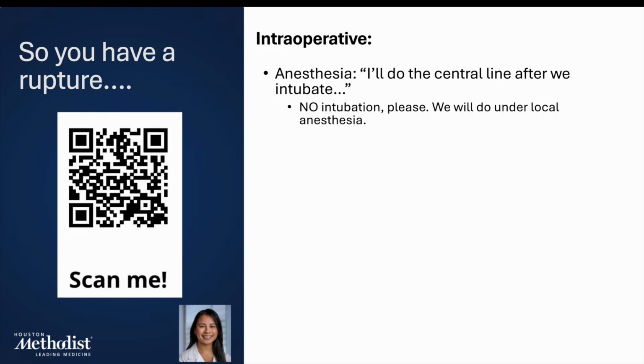No intubation, please. We will do this whole thing under local anesthesia, and this of course is to prevent any crash on induction. If you end up needing general anesthesia for cut downs in the groin or the belly, then generally you do this after you get some balloon control so you can stabilize the patient first and then you can put them to sleep safely.